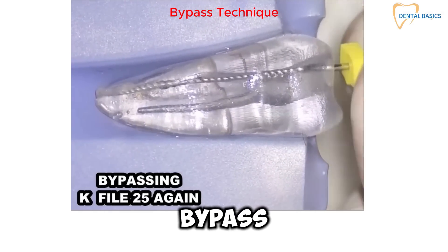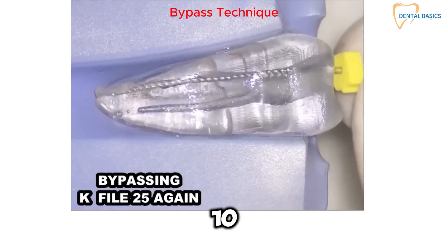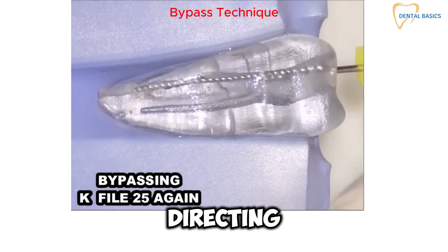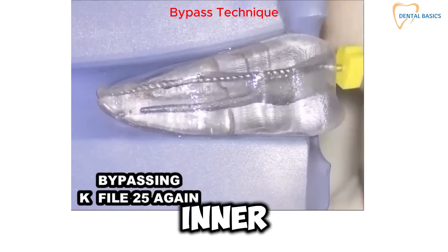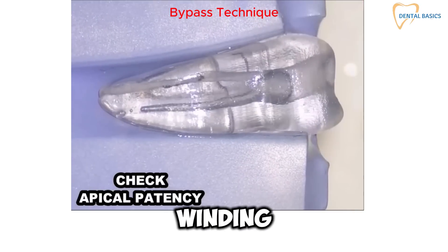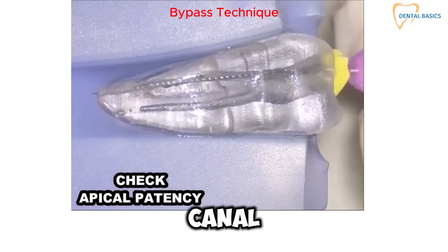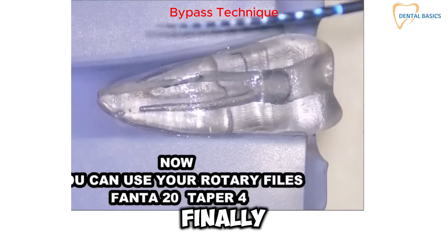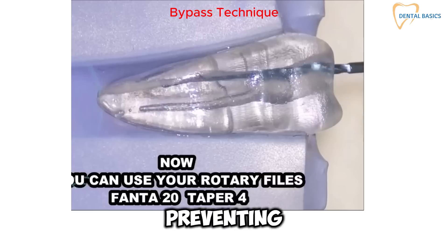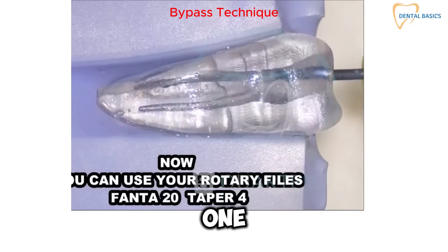Bypass maneuver: employ a pre-curved K-file size 10 to initiate the bypass, directing it towards the inner curve of the canal. Observe the file's winding motion as it progresses through the canal. Finally, remember that prevention is better than cure — preventing file breakage is better than dealing with a broken one.